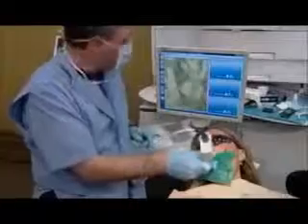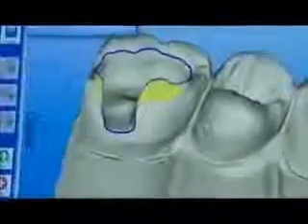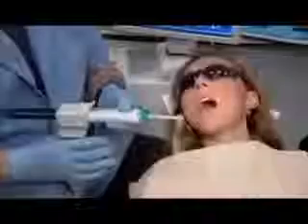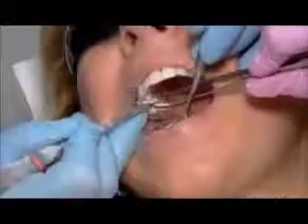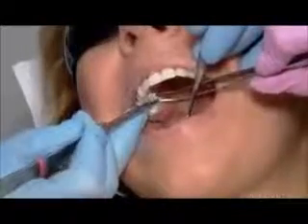He points a high-resolution LED camera at the tooth and downloads the image onto a computer, which converts it to 3D. Next, the dentist fills the cavity with silicone putty. When her teeth come together, they leave an impression in the putty that indicates her bite profile. Once the putty hardens, the dentist and his assistant chip off the excess.